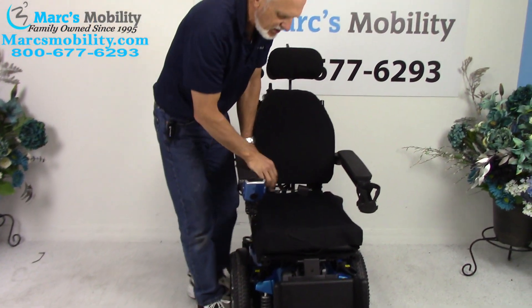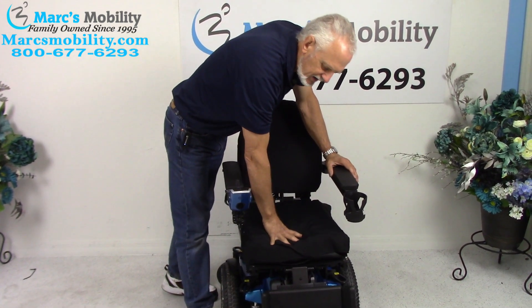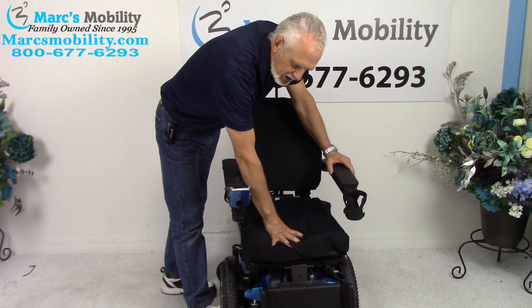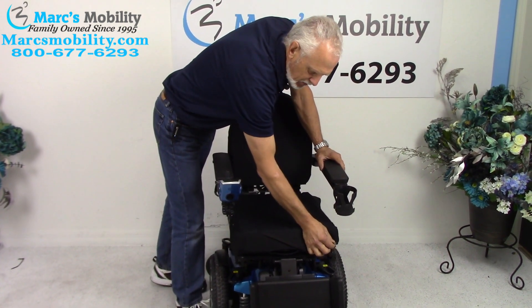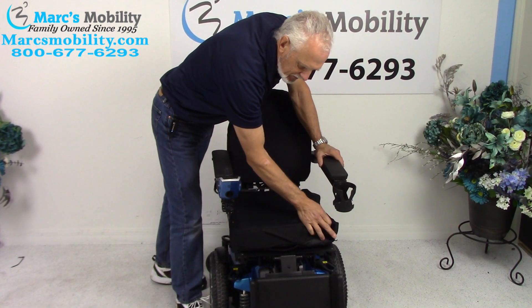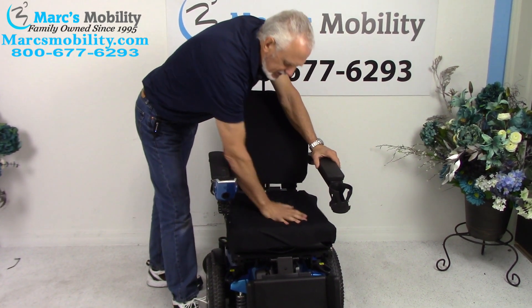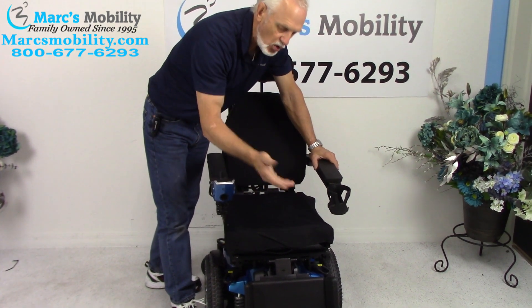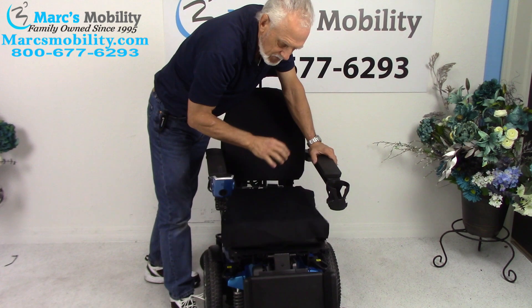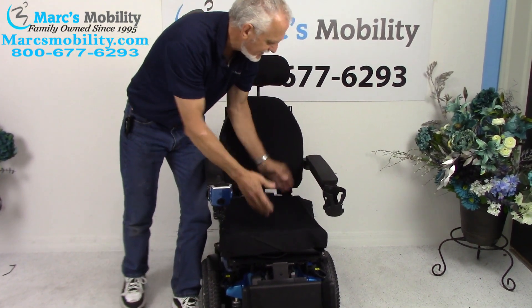The seat on this chair is 16 by 18. This is a Roho cushion — the most expensive cushion you can put on here. It's an air cushion; you can adjust the pressure by putting more air in or taking air out from this valve right here. A little plastic pump will come with the cushion. If you don't like the air cushion, you can just take it off and put your own cushion on.